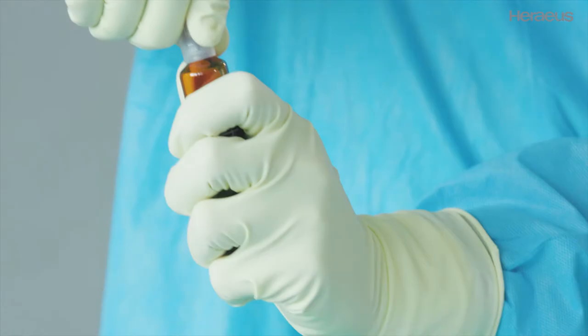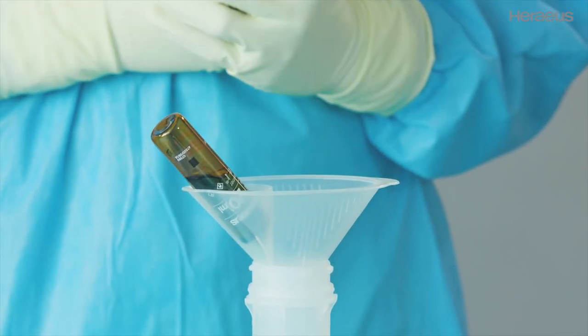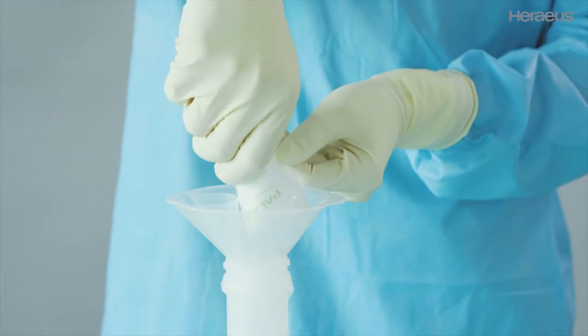Insert up to two pouches of bone cement powder and two ampoules containing monomer liquid in the tray. Open the ampoules at the predetermined breaking point and pour the monomer liquid onto the cartridge through the particle filter. Add the bone cement powder, ensuring all of the powder is emptied into the cartridge.